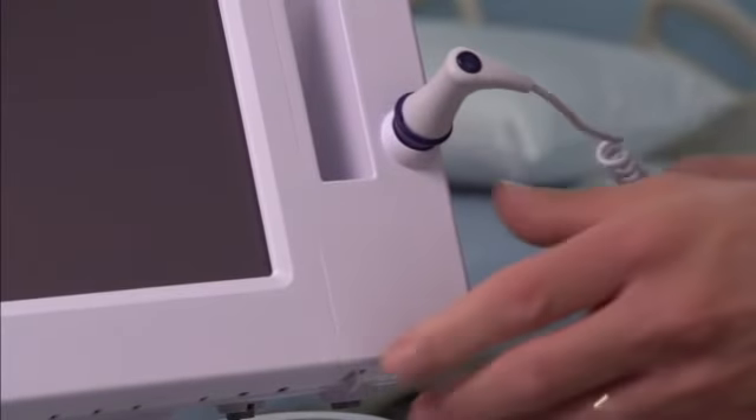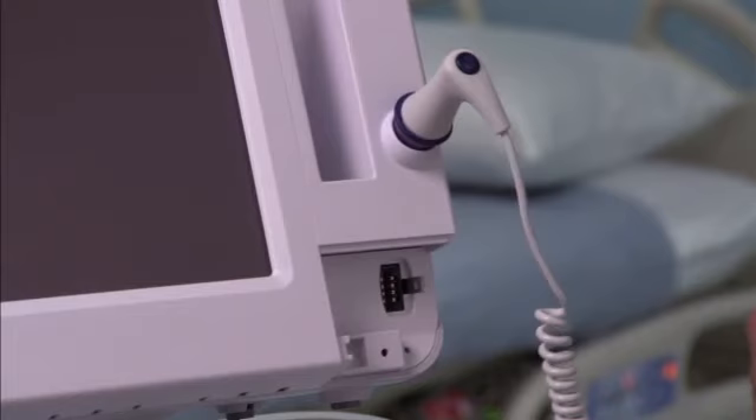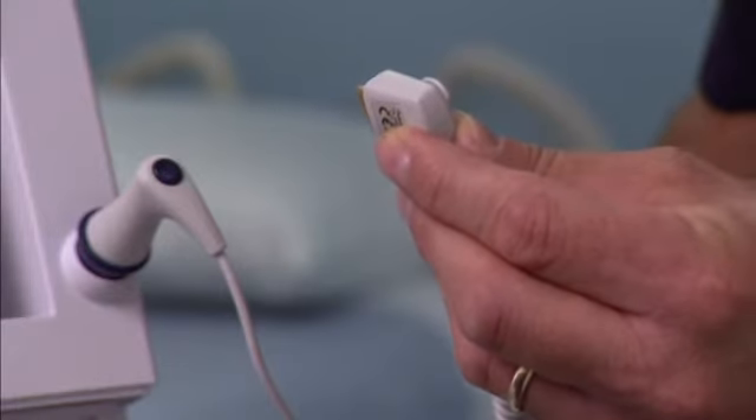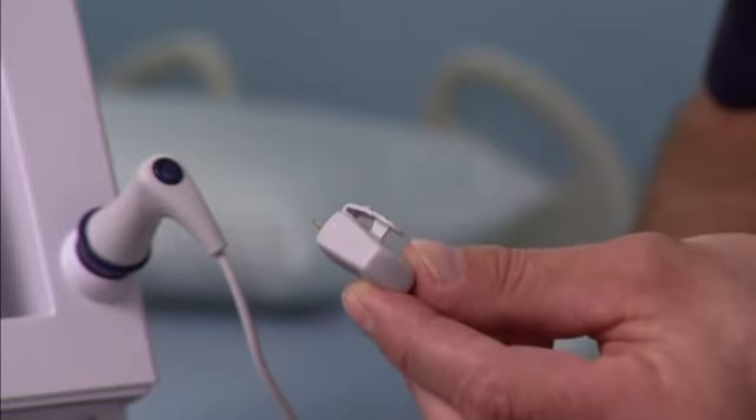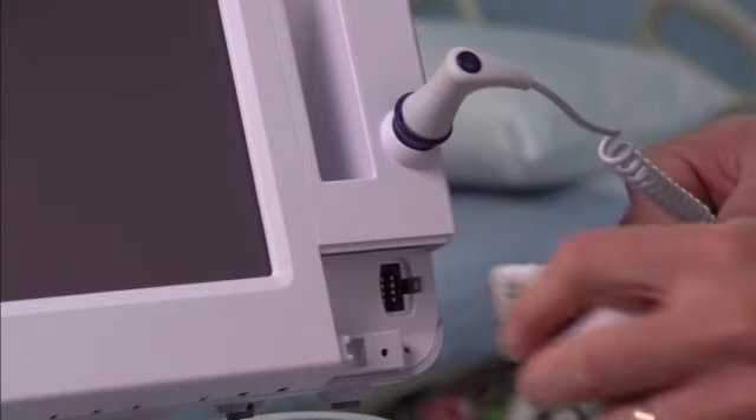First, remove the cover of the temperature module by pressing the tab and sliding the cover to the right. The cover is located at the bottom right of the monitor below the probe well. Hold the temperature probe cable connector with the spring tab on the right and insert it into the probe port of the temperature module.